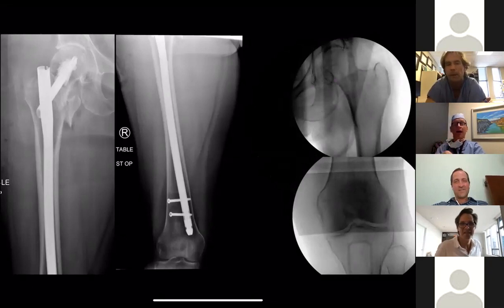So Greg, if you're present when you're putting those distal locks in, you're also going to appreciate that your hand is either doing this or it's doing that, right? Yeah, for sure. So I changed the position of the distal segment, or the nail, in order to get a more reasonable view. Now, I don't know if that's right or not. I'll let you know. I'm going to get a CT version study in order to find out how different she is than her other side.